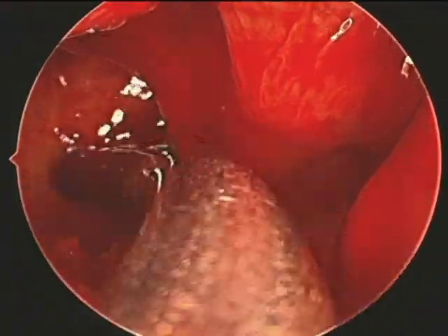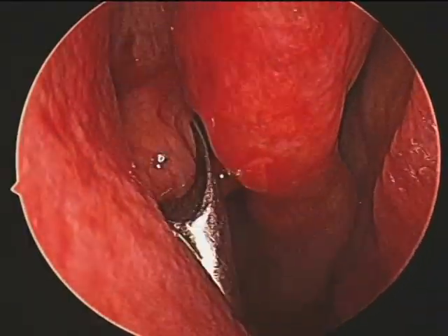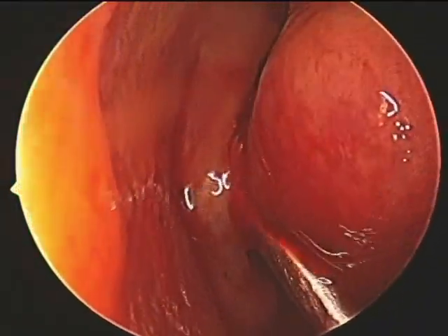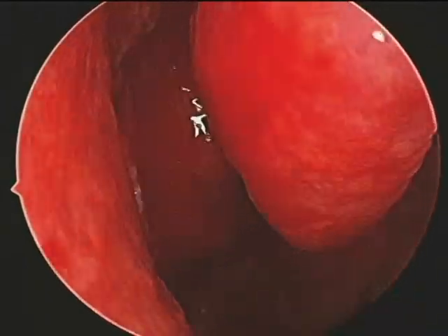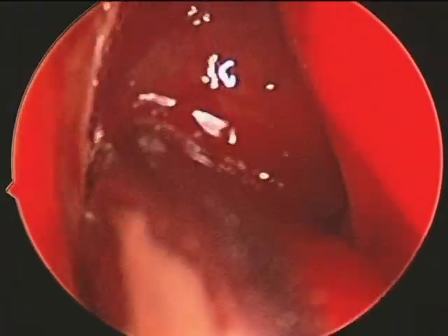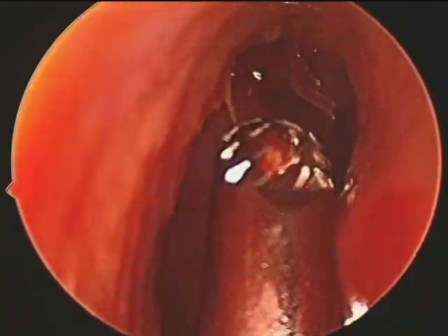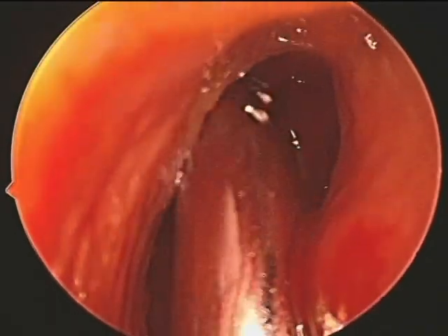That is the right maxillary sinus os — you can see the edematous mucosa, not as polypoidal as on the left. We use a spoon curette to fracture out the vertical portion of the uncinate process, and a 90-degree Blakesley forceps to elevate the horizontal portion of the uncinate process, giving an excellent view into the surgical cavity. We follow the M-line and identify the lamina papyracea early in surgery. That is the remnant of the agger nasi cell, and then we identify the hard frontal nasal beak.